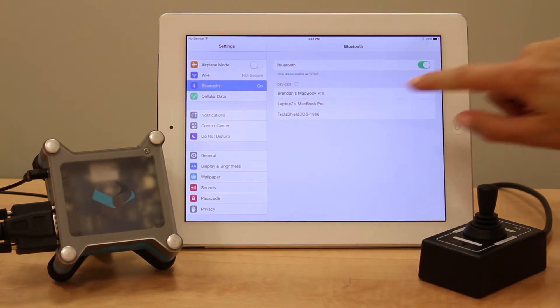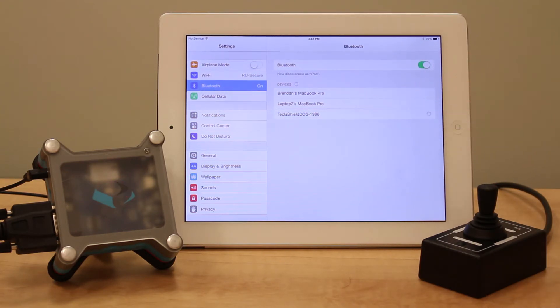You'll see Tecla Shield DOS along with a few random numbers appear under the list of devices. Select Tecla Shield DOS. Once you see it under My Devices as connected, you can proceed to the next step.